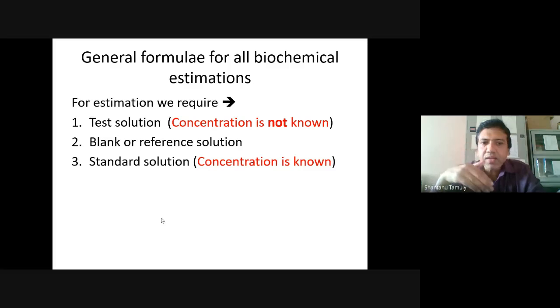Then the third is the standard solution. The standard solution is the solution where the concentration is already known to you. Say, for example, if you want to estimate cholesterol in your sample, you should have a standard solution of cholesterol where you know the concentration.